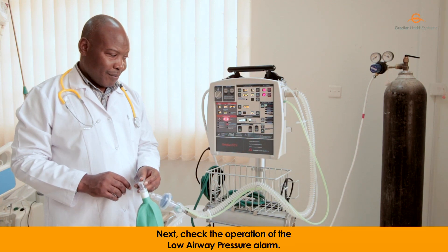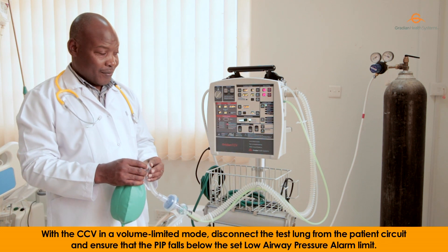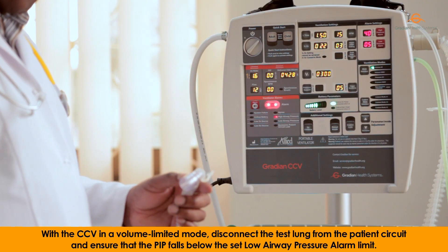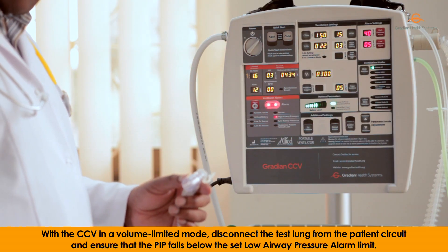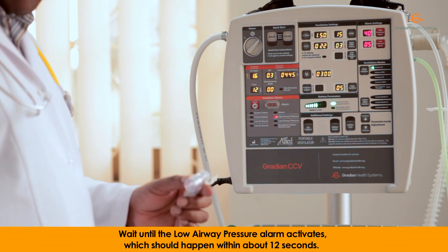Next, check the operation of the low airway pressure alarm. With the CCV in a volume limited mode, disconnect the test lung from the patient circuit. Ensure that the PIP falls below the set low airway pressure alarm limit. Wait until the low airway pressure alarm activates, which should happen within about 12 seconds.